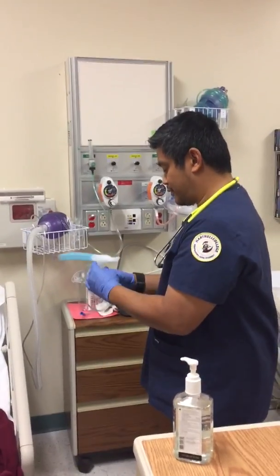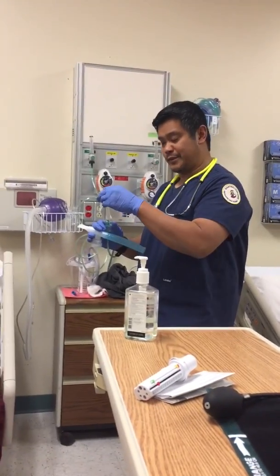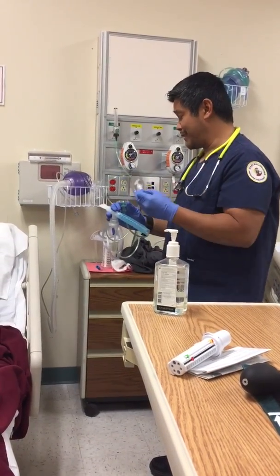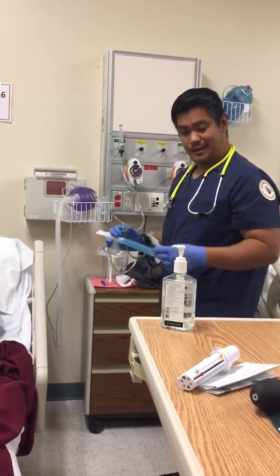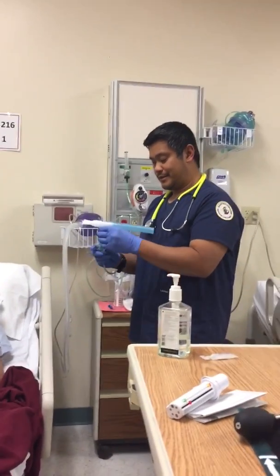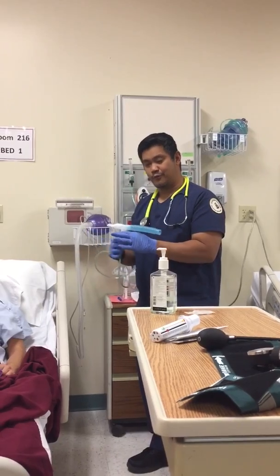So in this cup right over here, we're going to pour in your medication. And when we do pour it in, we're not going to touch the sides to contaminate the cup and the medication. So we're going to pour that in there right over here. This treatment's going to last about 5 to 15 minutes, and I'll be here for the entire time. We're not actually going to pour this in or turn on the device, but once we do turn on the device, get the air coming in. It's going to mist from the front as well as the back.